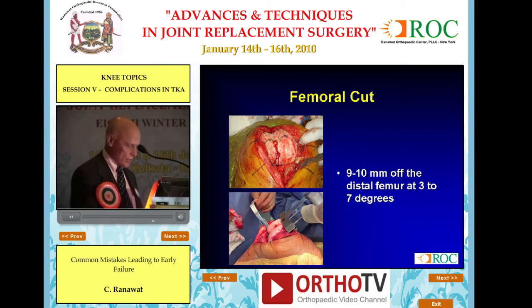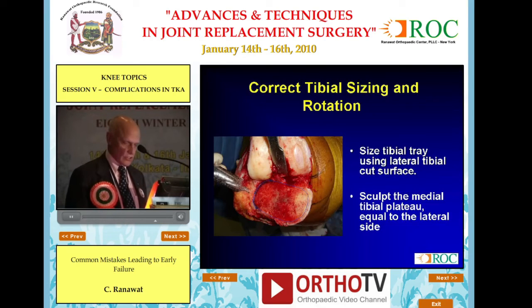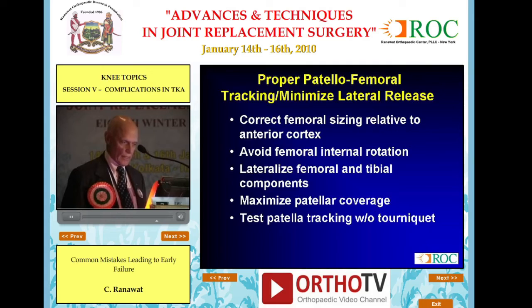Entering the femoral canal is critical. It is on this line, from the patellofemoral joint to the tibiofemoral joint, and just kissing that line is the hole. That's the center of the femur. Extension gap, sizing the tibia, posterior femoral cut parallel to the tibial cut, restore the offset, correct size the femur, lateralize the femur, lateralize the tibia, rotate it properly, and if you did all that, your patella will track and you don't need to do any releases.